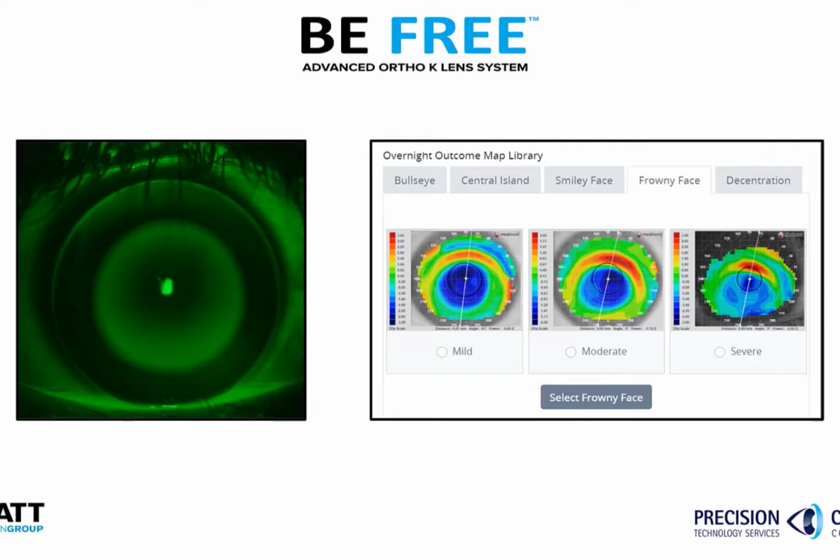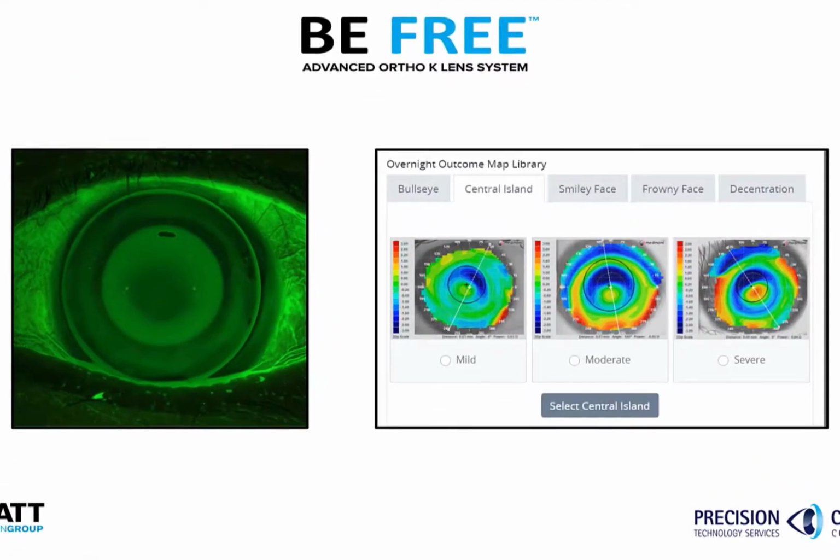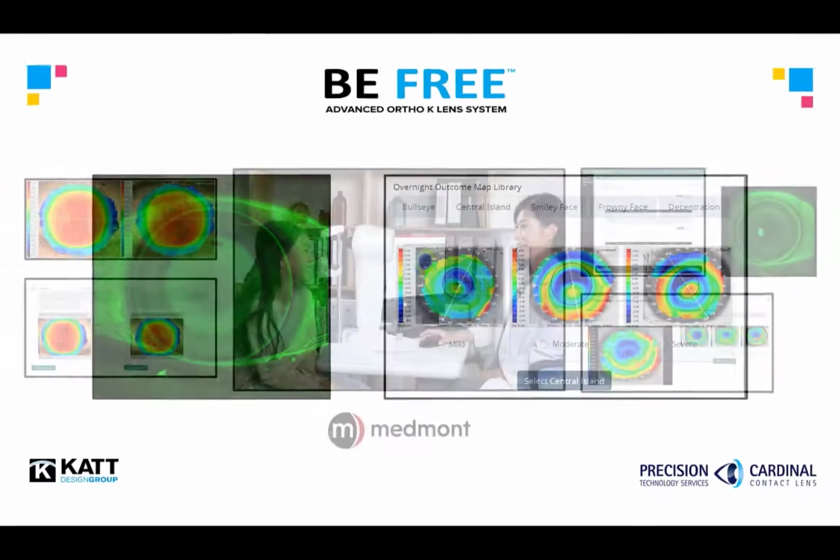Both may be caused by inadequate edge lift. Excessive apical clearance and persistent dimple veiling are resolved with the central island response, which reduces the vault and tear thickness under the lens. Based on the appearance, choose mild, moderate, or severe.